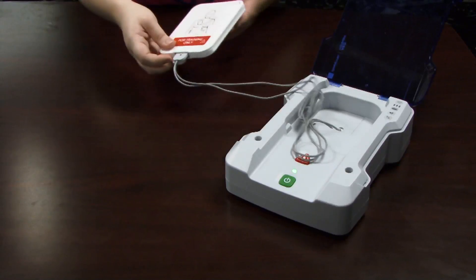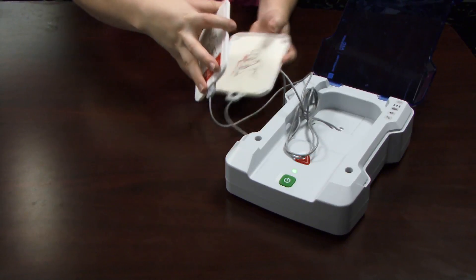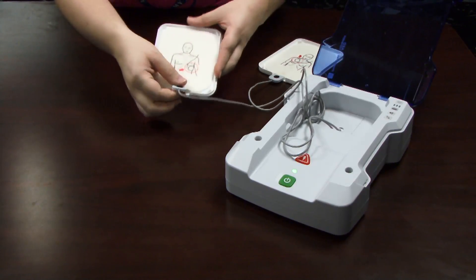Take the pads out of their training pad case. Place the pad on a flat surface, graphic side up.